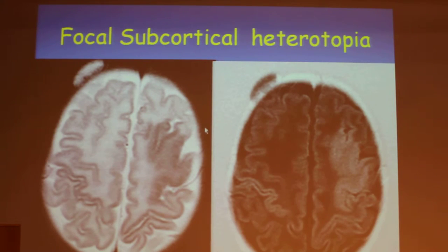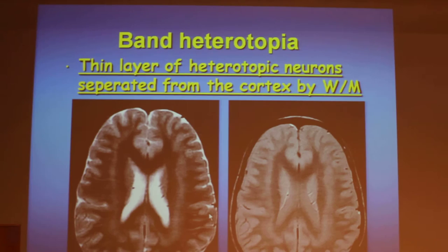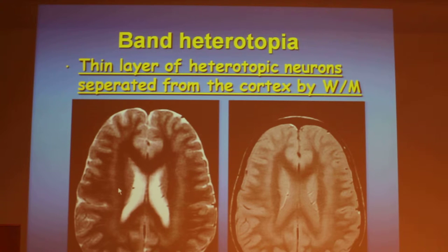Another example of a focus of cortical heterotopia is this case with a very thick gray matter and blurring of the gray-white matter differentiation. The band heterotopia is actually when the neurons started to do the migration towards the cortex and stopped as a band in the middle.